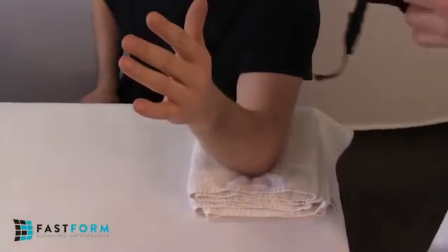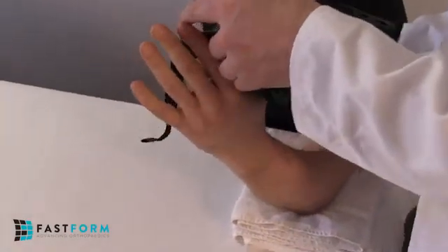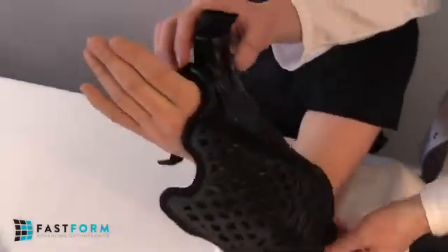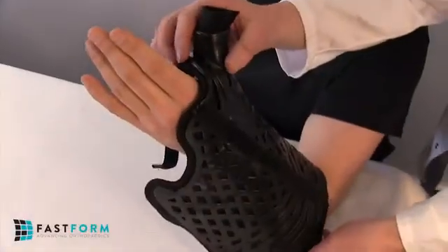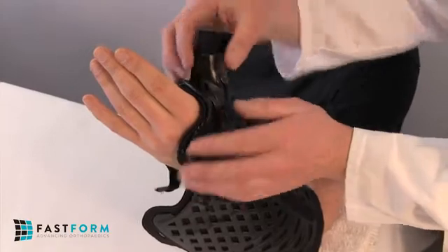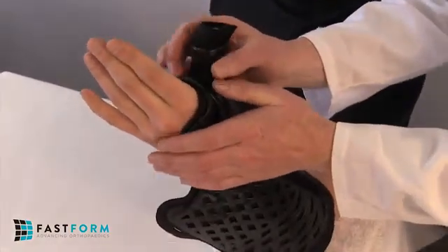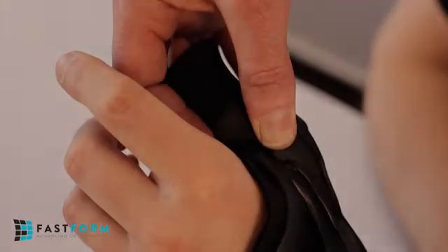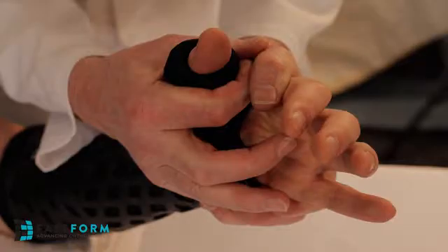To apply the thumb spica, rest the patient's elbow on the work surface at a 45-degree angle with the thumb abducted. With the thumb extended upwards, place it through the thumb hole and spica. First, align the radial hinge along the radius, while ensuring that the distal dorsal end is parallel to the knuckles. Then, press the spica firmly down over the thumb to ensure the thumb hole bridge sits snugly into the webbing between the thumb and index finger.